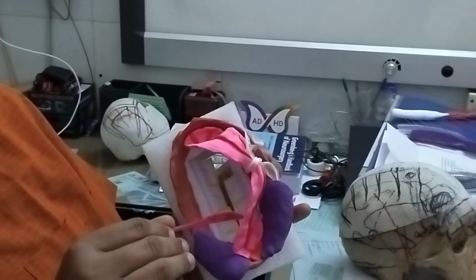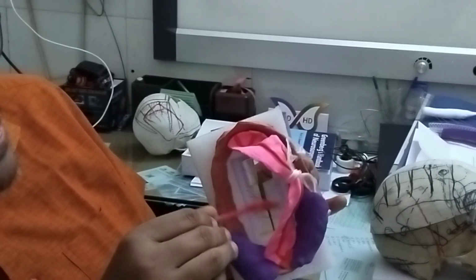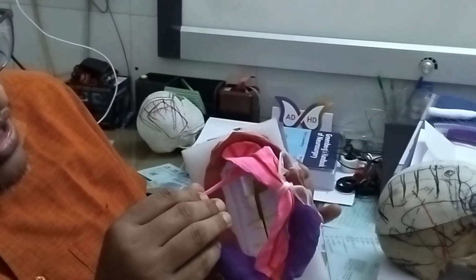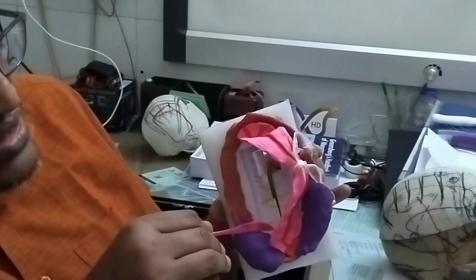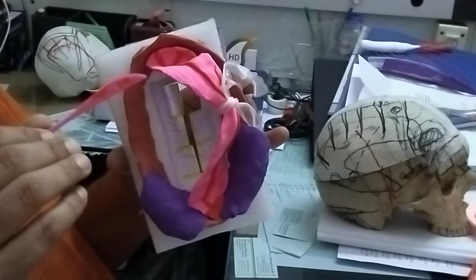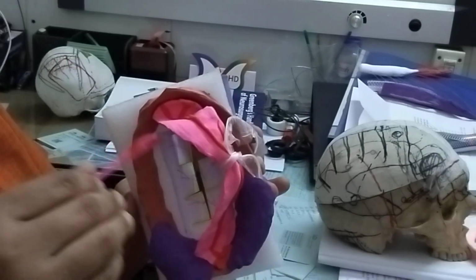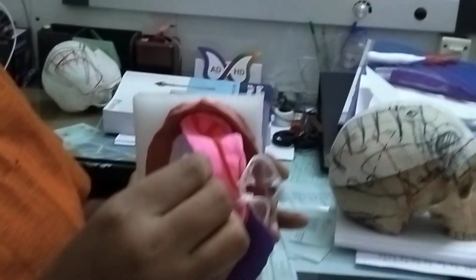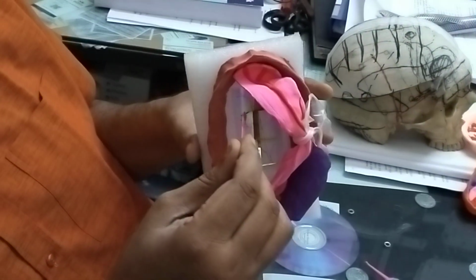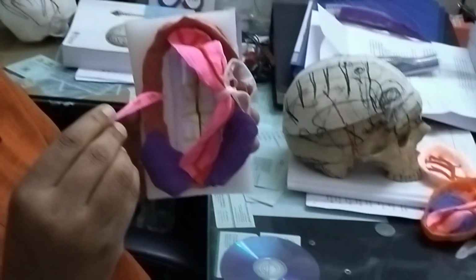Now we have a design to make a 4 by 8 centimeter craniotomy, and during craniotomy we give the vertical bone cut first and the transverse cut later. During the transverse cut we must keep the safety of the galeovascular flap, and we use a small strong instrument to protect the galeovascular flap from any type of trauma during craniotomy. After craniotomy, we find the dura here.